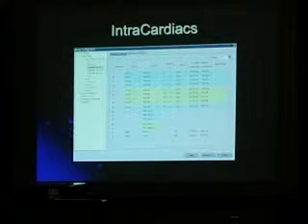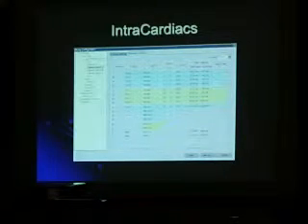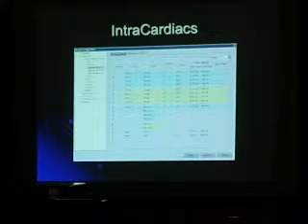The X-ray systems, because they run at three-phase power, are 180 hertz. You can get some noise off of them if they're not shielded correctly. So if I take this from 500 to 150, what do you think that does to my X-ray noise interference and my computer interference? Goodbye. I always take this from 500 to 150 before I turn on my notch filter. I have some sites that don't use anything but 150 now for everything.